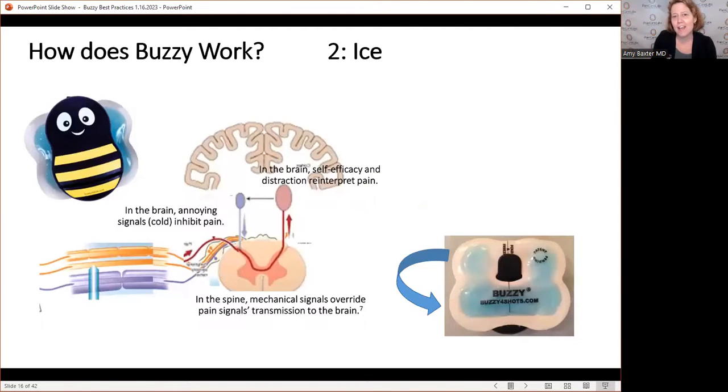All right, so now adding those C fibers, the ice. In the brain, the pain pathway goes through the thalamus and then to this place called the anterior cingulate cortex. And it is really assessing whether or not, it assesses everything. It's the arbiter of cognitive conflict. Do I worry? Do I not worry? Is this a big deal? Is it not? How do I solve the problem? It doesn't solve the problem. It'll then pass it other places. It's just, what do I need to think about here? So what ice does is it triggers in the ACC an assessment of risk.